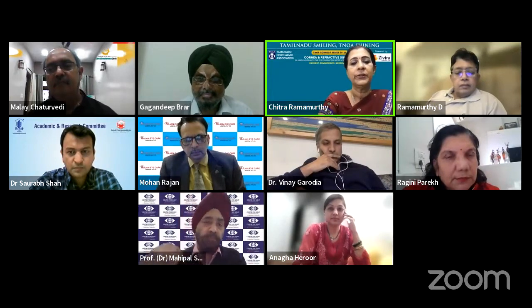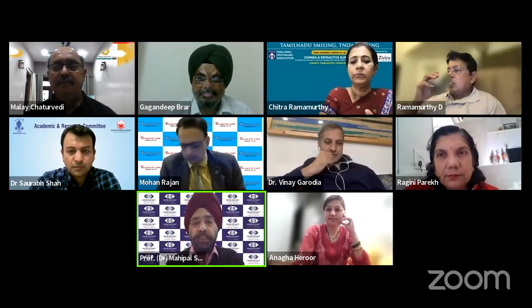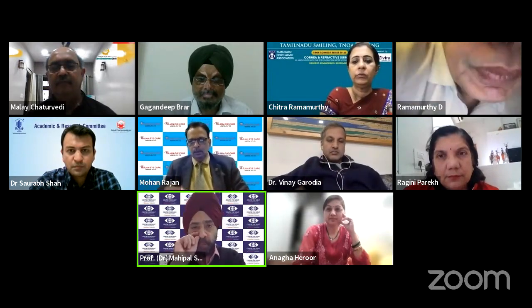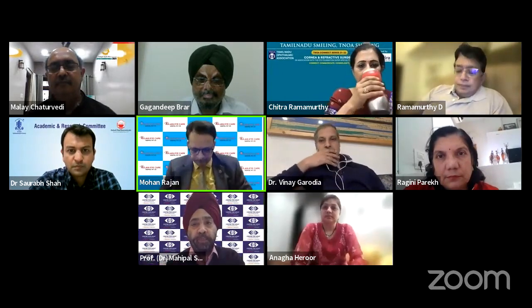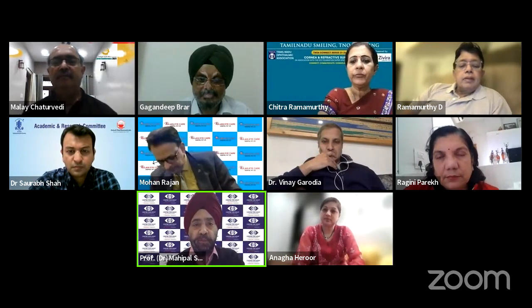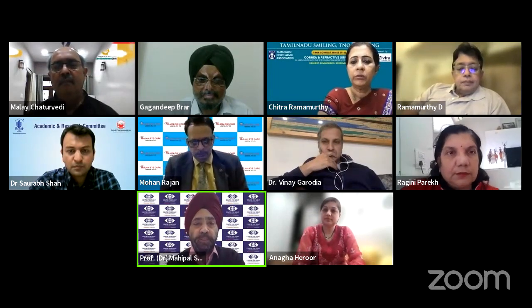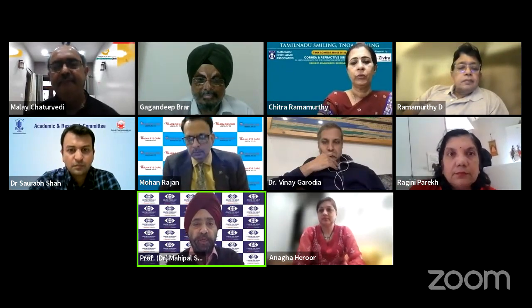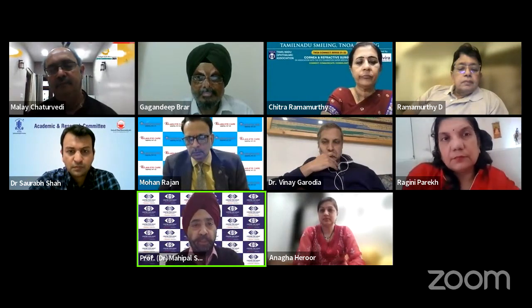No. The trifocal, all these lenses, the decay is much worse if you are making the patient myopic. So whatever is being told is to keep it to a slight hyperopia rather than a myopia. If you are looking at a trifocal lens, your IOL power calculation should be accurate. And you should try not to give a myopia, because the degradation in the quality of vision is pretty significant. The blur is much more in a myopic residual than with emmetropia or a slight hyperopia.